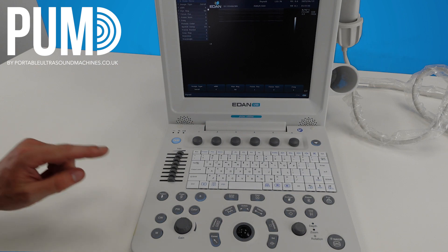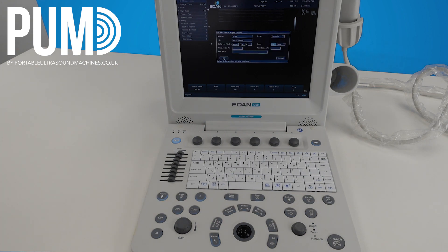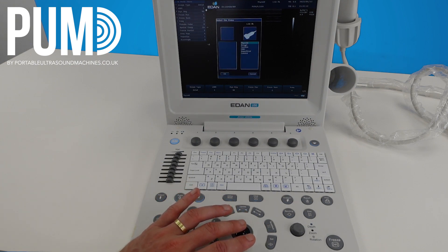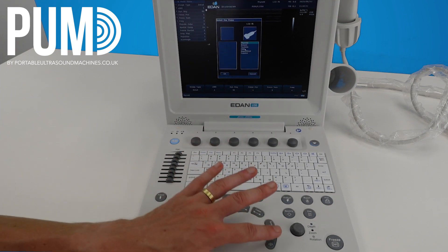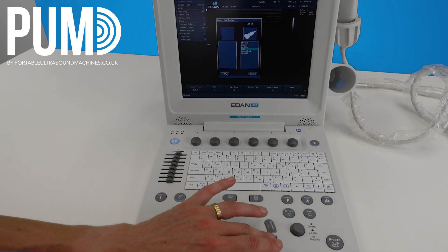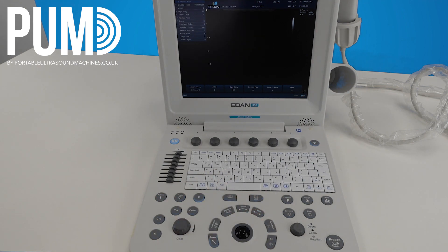To start an exam we would hit the patient button to bring up our patient data input box. I've already got patient data in here but normally this would appear blank and you just type in the patient details and when you're happy select OK. Depending on what mode you're in or what transducer you've got connected, you want to hit probe and just make sure you've selected the most suitable preset for the scan you're doing. So you might want to choose an MSK preset depending on what scan you're doing, then click OK. I recommend doing this at the start of every exam just to make sure you're definitely in the right preset.